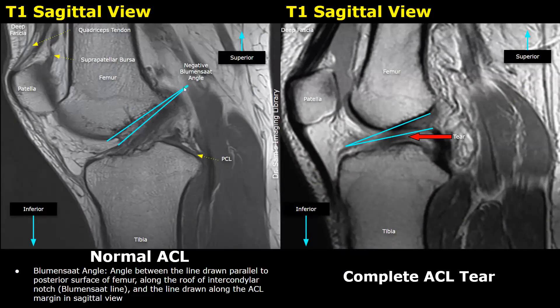The Blumensat line is the line drawn parallel to the posterior surface of the femur along the roof of the intercondylar notch. A second line is drawn along the ACL margin in the sagittal plane. The angle between these two lines is the Blumensat angle.